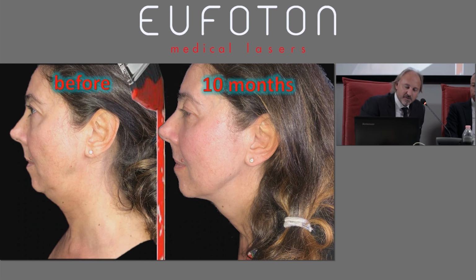That's my way to answer the question about barcode. The stimulation with subdermal fiber in a way can help with the barcode. It's not sufficient, but it's something helping us. Of course, I would never buy Endolift for this kind of indication. It's not a method for the barcode, but this can help.